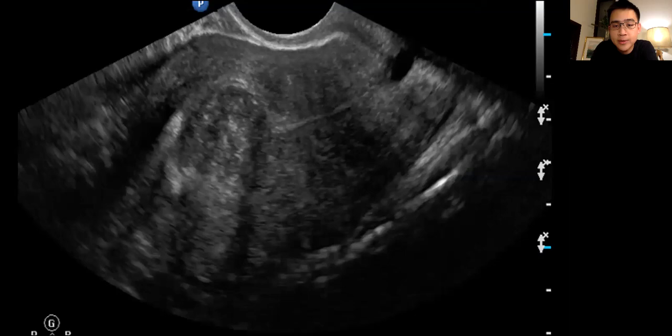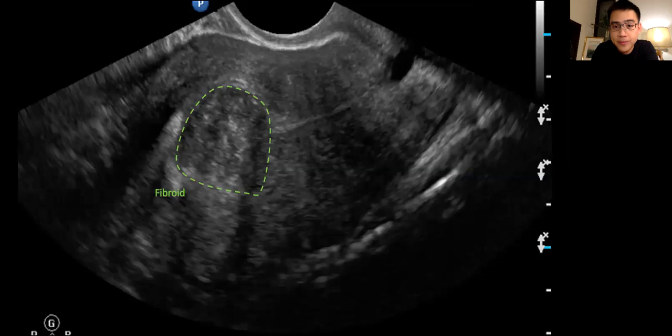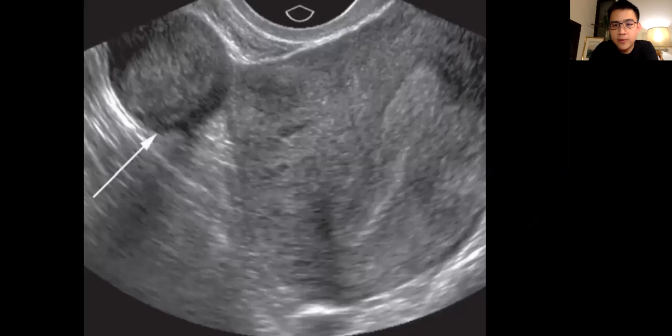This is an example of a transvaginal ultrasound scan where the probe is placed within the vagina. There is better clarity and detail of the uterus, and therefore we suggest both transabdominal and transvaginal ultrasound scans for increased accuracy. In this patient there is a submucosal fibroid which indents upon the endometrial cavity of the uterus.